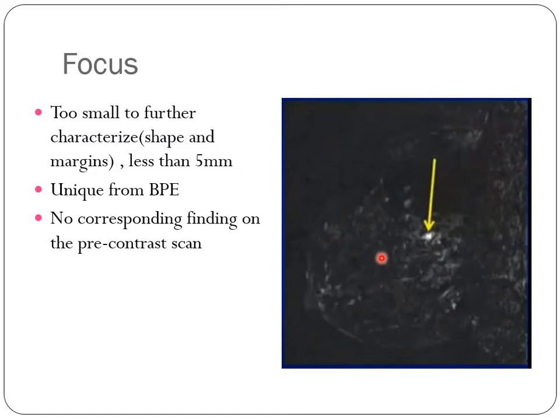No corresponding findings. Here you may face a problem with the multiple focal enhancement: how do you check whether this multiple focal enhancement is normal or abnormal? You have to use the other modalities, I mean the ultrasound and the mammogram. You have to check whether there is a real finding in the mammogram or ultrasound. Take this focal enhancement seriously. It's not only focal enhancement and benign.